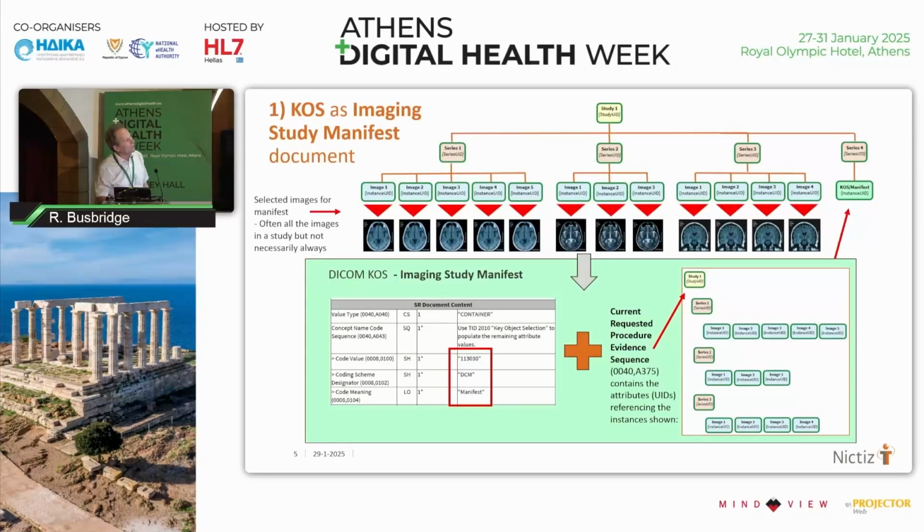And what you end up with, by creating that, at the series level, is another DICOM object, which is in fact the manifest. So within that study, you've got the underlying series with all the descriptions of their images, and a second, in this case, a fourth series that contains the manifest itself, which is the description of the underlying study.